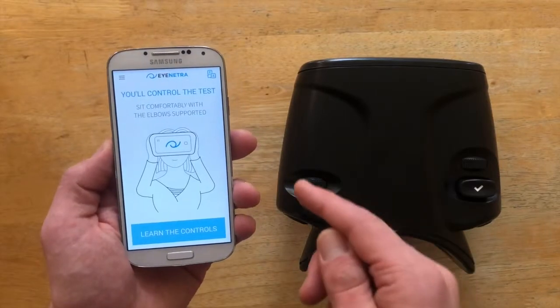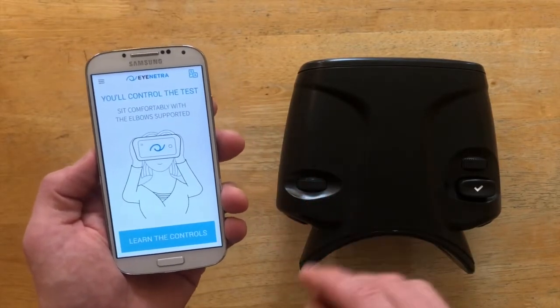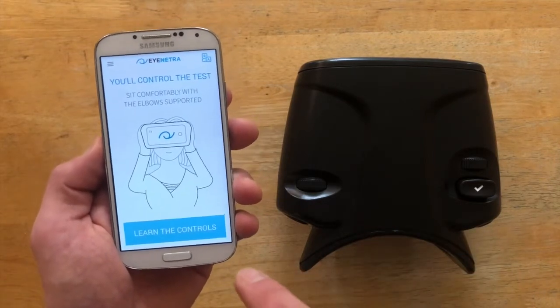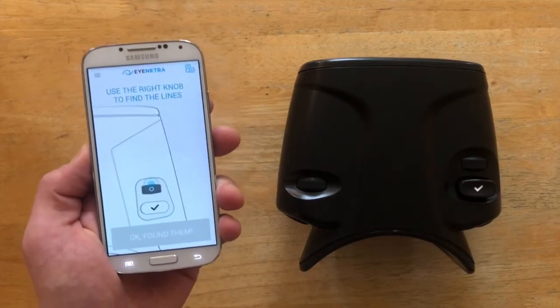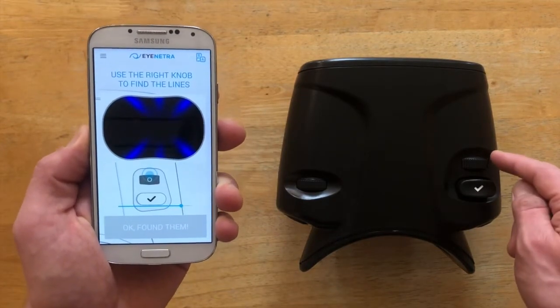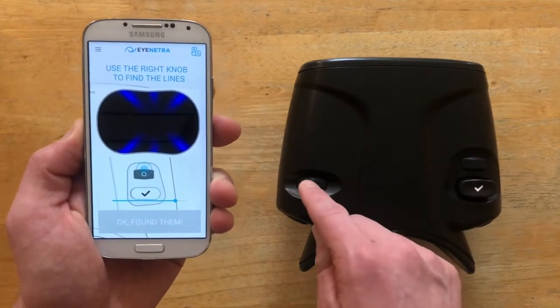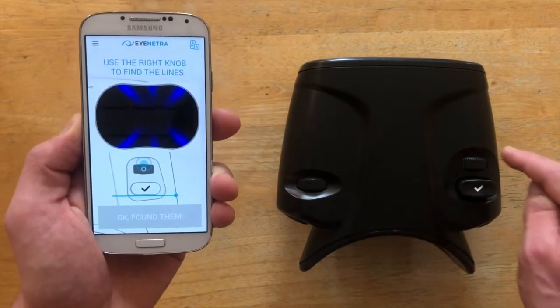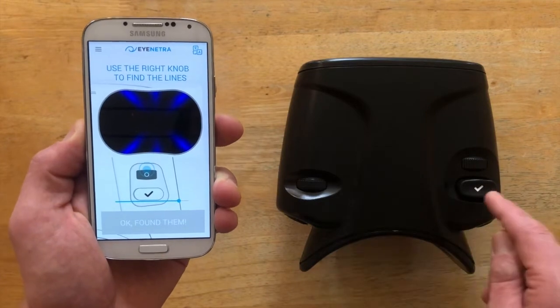This first screen of the tutorial is alerting us to proper grip and posture for the device, which we'll get to in just a second. But first, let's learn the controls. I like to break the test down into three very simple steps: find the images with the right knob, align them with the left knob, and click to confirm. Find, align, and confirm.